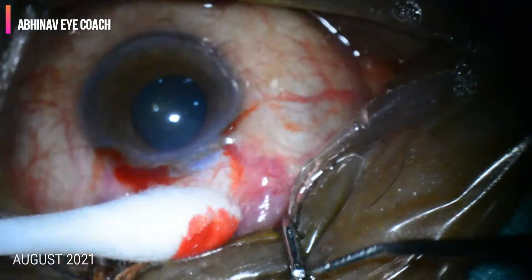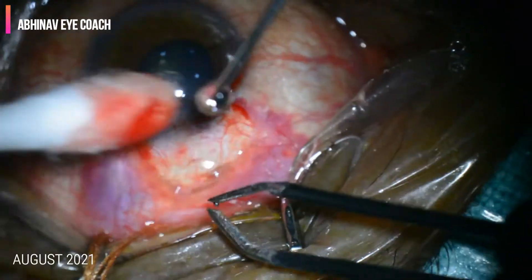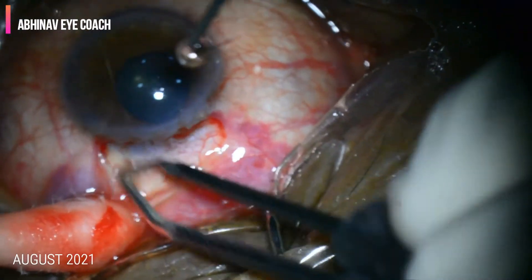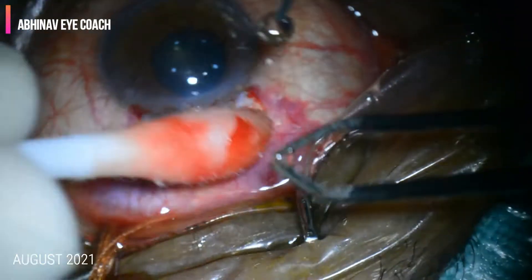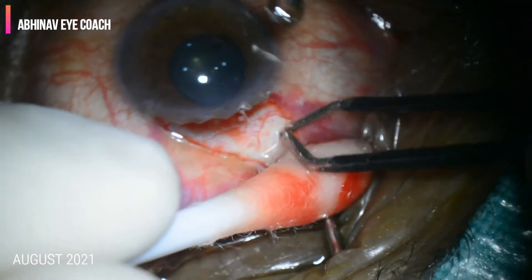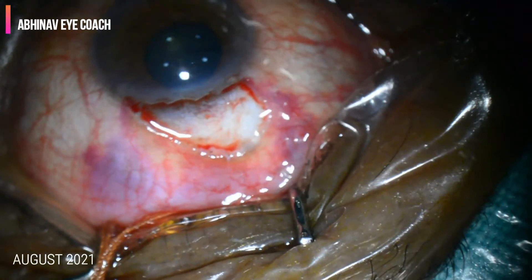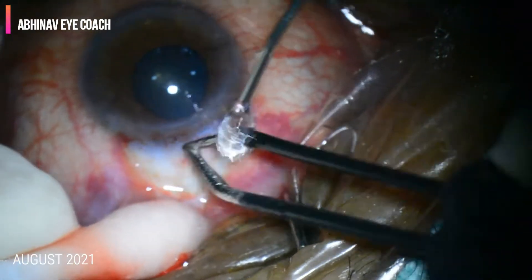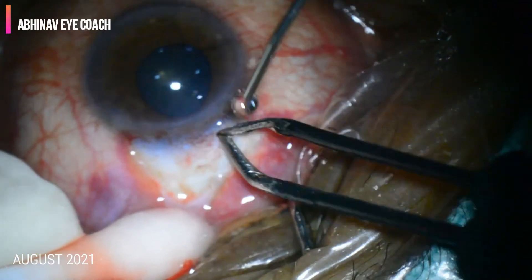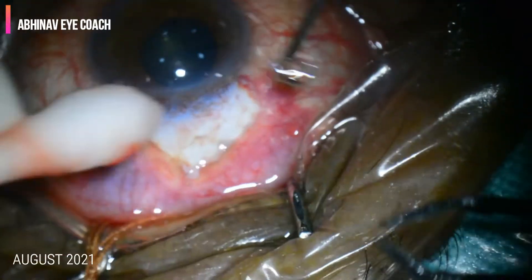Mitomycin C is an anti-metabolite which delays scarring or fibrosis and increases the life of a filtering bleb. Cautery is performed to achieve hemostasis. Wet bipolar cautery may be used. Excess cautery should be avoided, and cautery is avoided near the limbus.